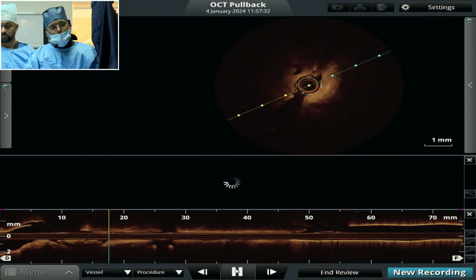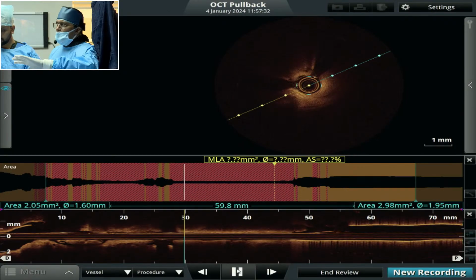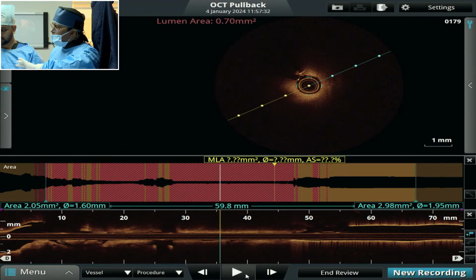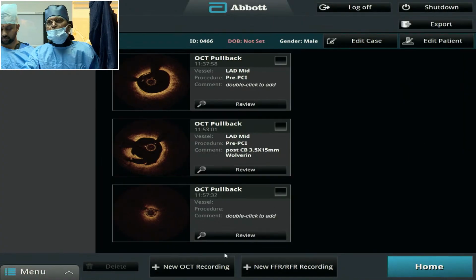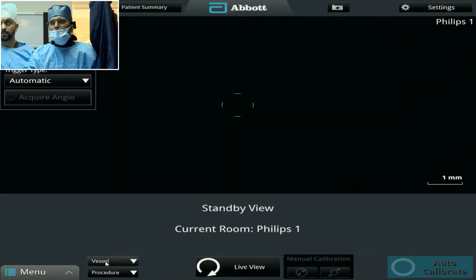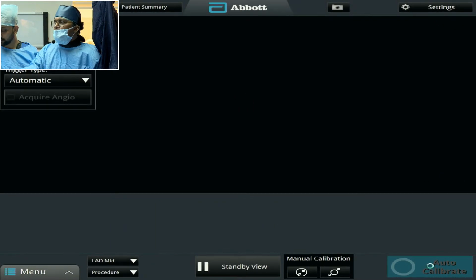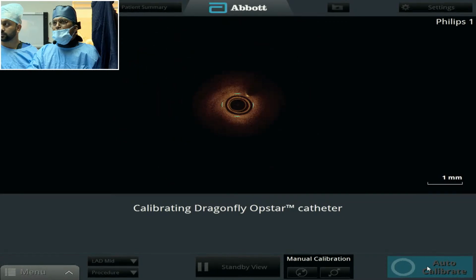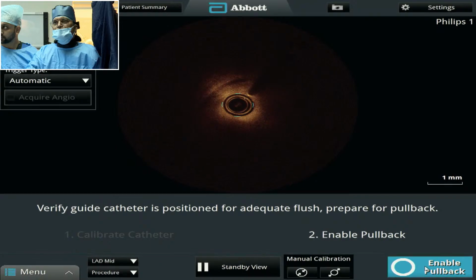I will do it. It will always take some time to move the marker. Keep it there again, wait. No need to hurry. Last 2 ml, wait. Are you ready? Continuously apply pressure and wait there. Last 2 mm, leave it. Ready? Go ahead. Continue.